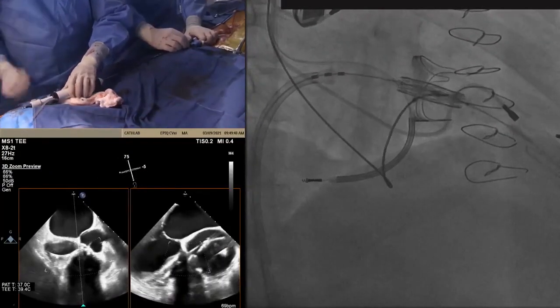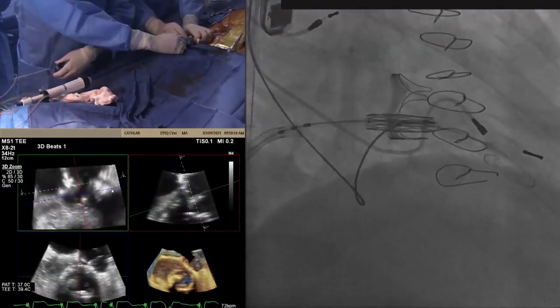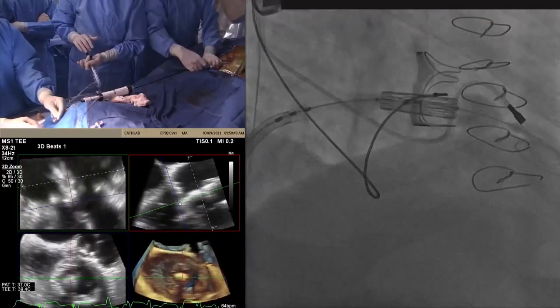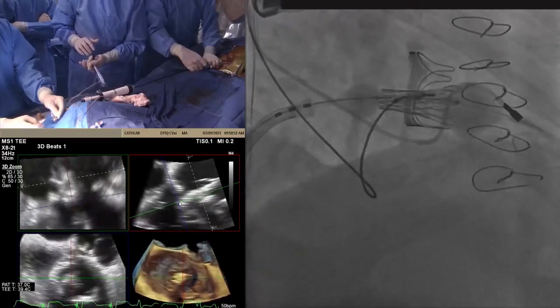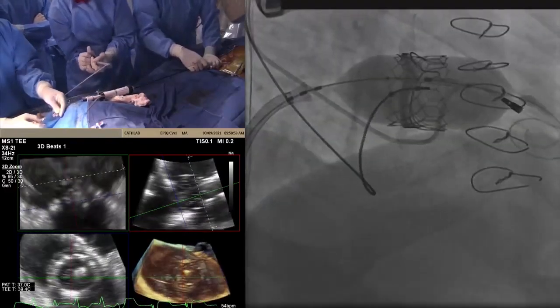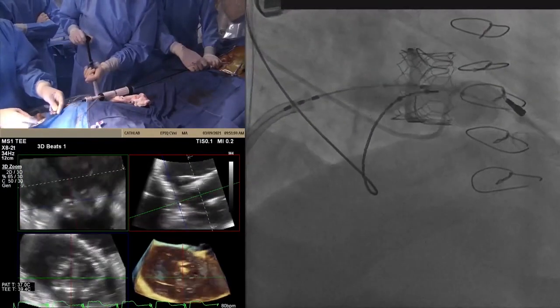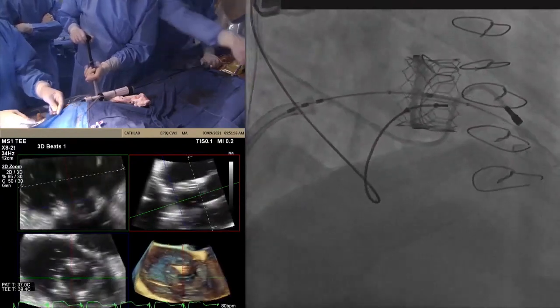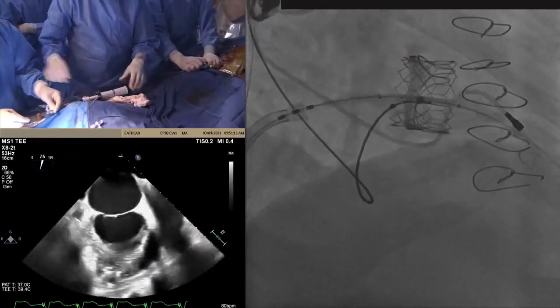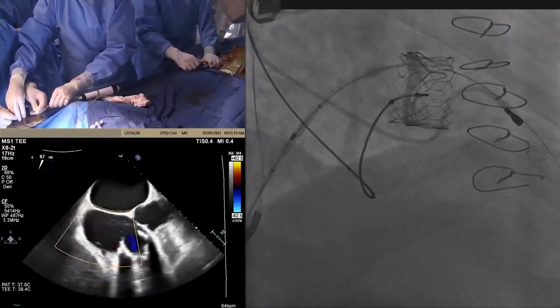Everything is looking good. That's very good. This is good here. Yeah. Excellent. I'm going up. Keep holding. All the way up. Okay, full. Good. And I'm full and zero. Okay, we need a little resuscitation. Okay, pressure is good. Yeah, blood pressure is 107. Very nice deployment. Okay, zero, coming out. 0 degrees. Yeah. The valve looks okay. We're coming out. Good.